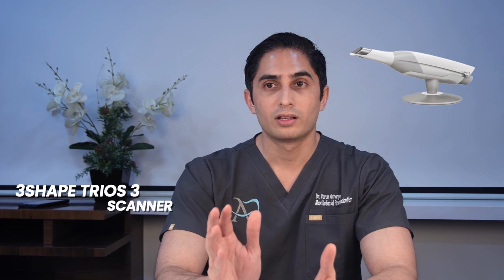The scanner which I have the most experience with is the 3Shape Trios 3. It's a wired scanner. There was a learning curve, and you guys are going to face this.